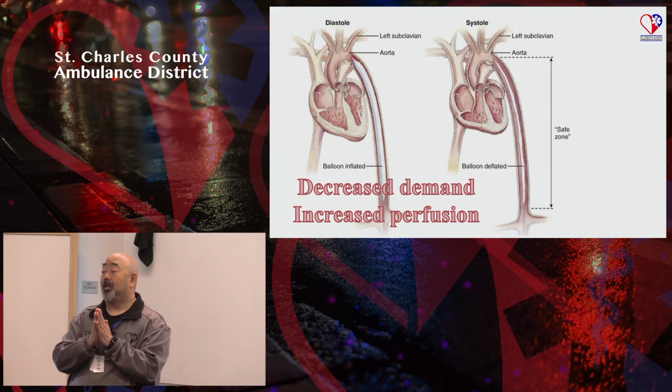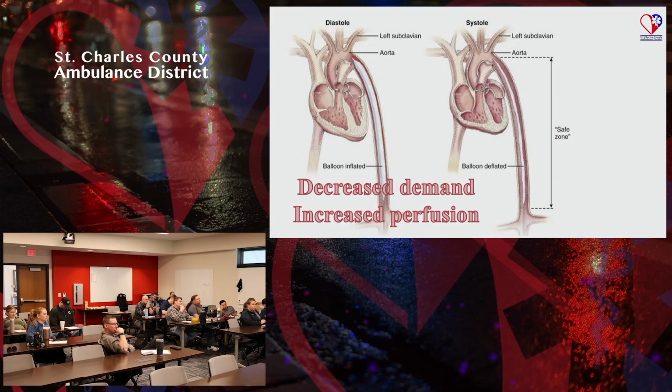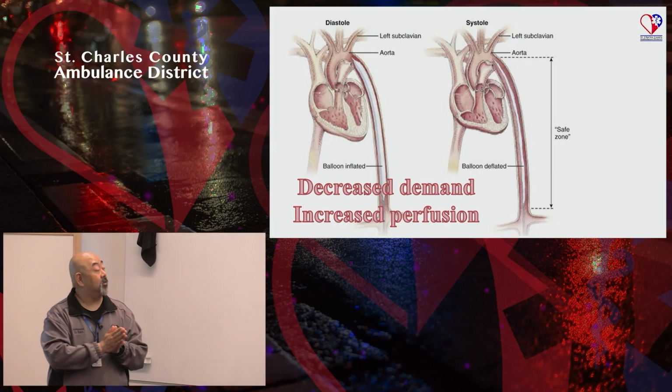Decrease in the demand during deflation, because the negative pressure from the deflation is pulling the blood out, so the heart doesn't have to work as hard to eject it. All right, so nothing happens during inflation? Inflation is whenever you're adding back pressure and it pushes back into the coronary arteries. Very good. So my question was kind of a trick question. You're both right, because it happens during both, during inflation of the balloon and deflation of the balloon.